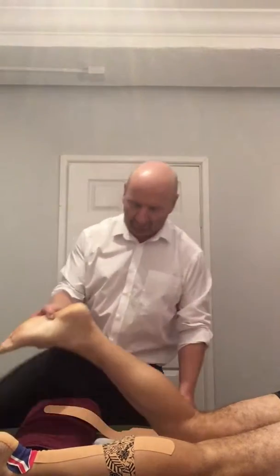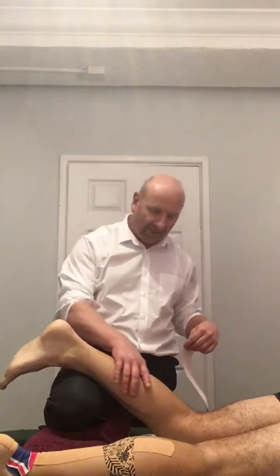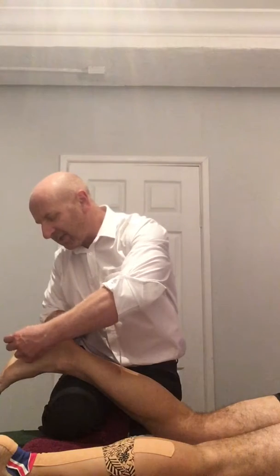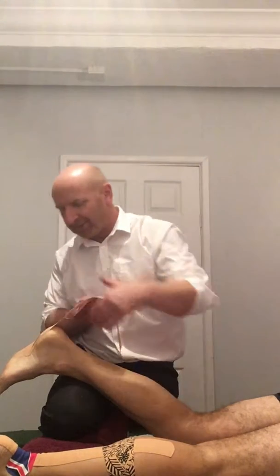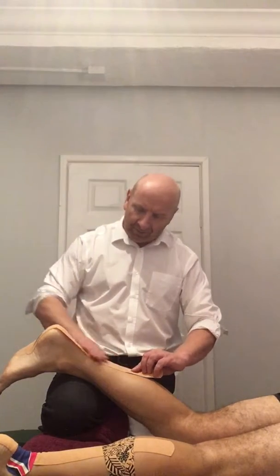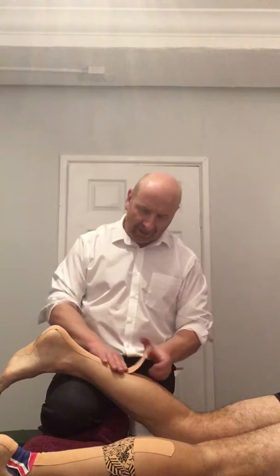So what we're going to do is put his ankle into plantar flexion to access this gastroc here. We're going to start by putting the tape on the bottom of the heel. This is really good for Achilles problems, plantar fascia problems, and tendinopathies. I've put a bit of pre-spray application, and I'm just going to load it up the base of his leg, but not too much stretch at all, and just lower that down.